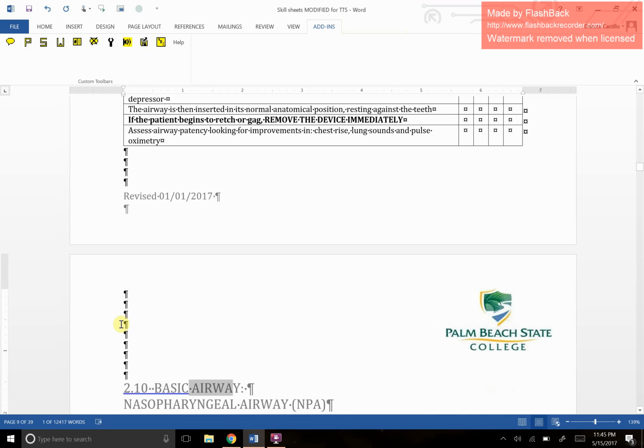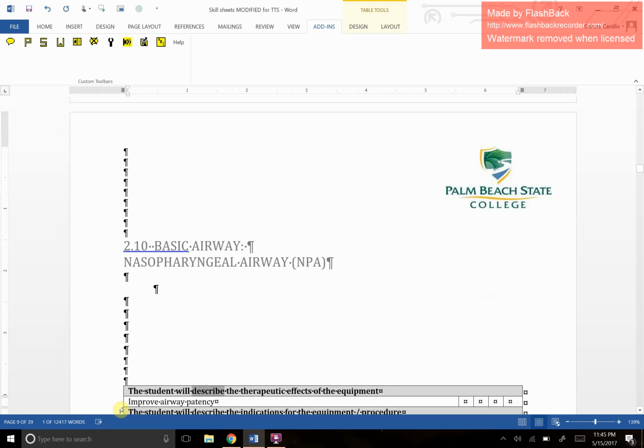2.10 Basic Airway. Nasopharyngeal airway, NPA. The student will describe the therapeutic effects of the equipment.